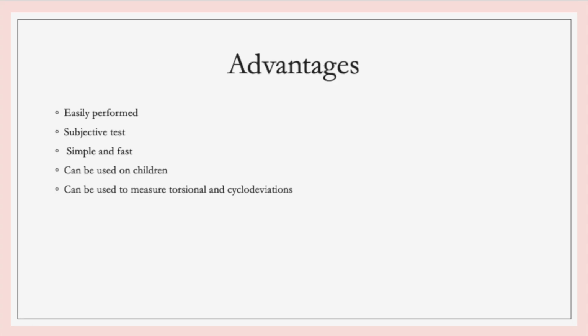Advantages of the Maddox rod test. The test can be easily performed. It is a subjective test. It is simple and fast, can be used on children, and can be used to measure torsional and cyclodeviations.